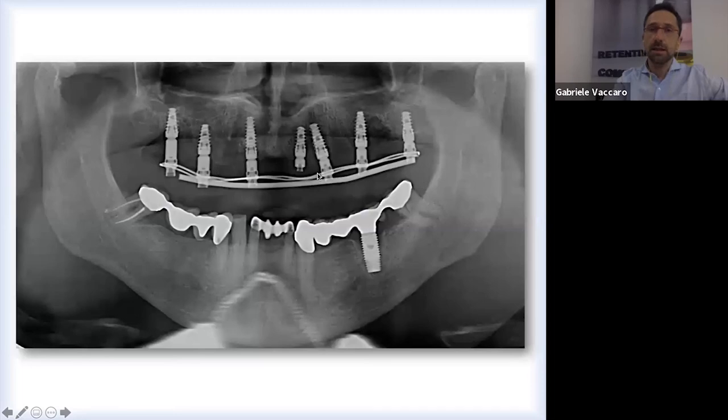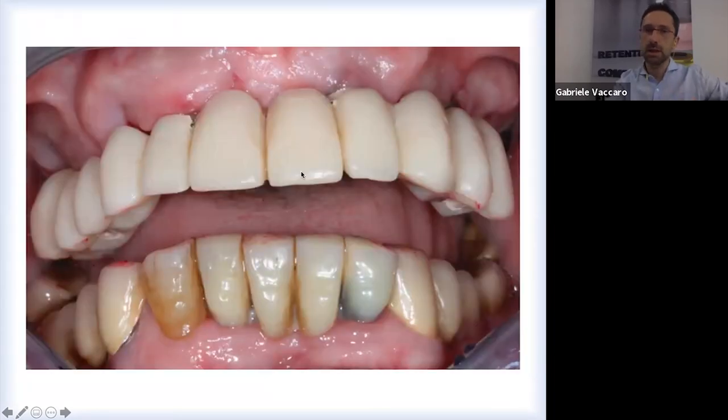One important thing, this abutment, this implant, sorry, didn't reach the right torque for the immediate load. But that doesn't matter because I didn't load it with a temporary bridge. I put my healing screw, my equator, over that, just the same, because this is my permanent healing screw. After that, in the afternoon, I put my temporary.